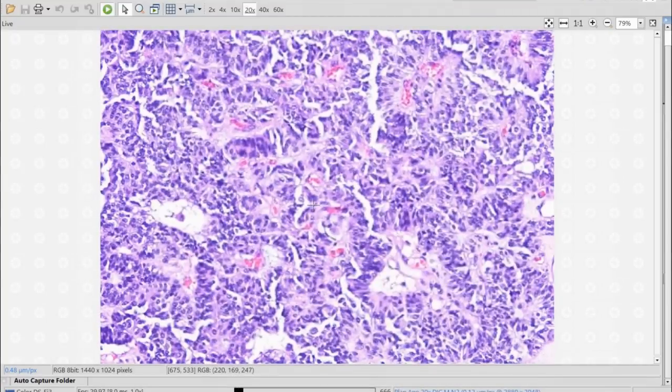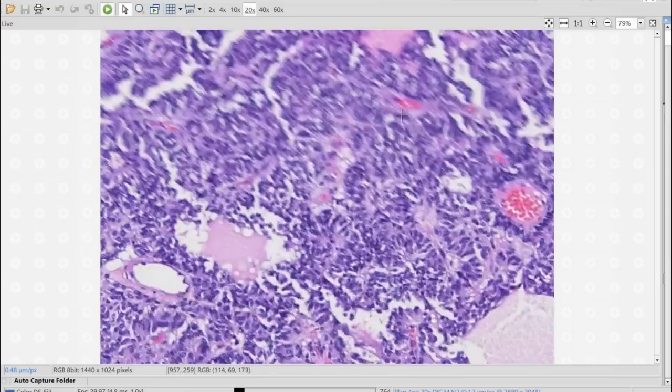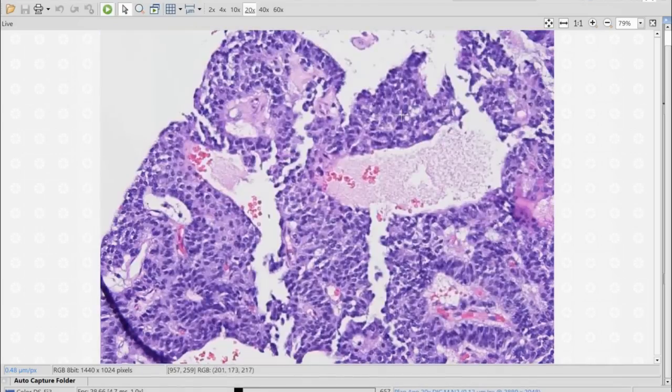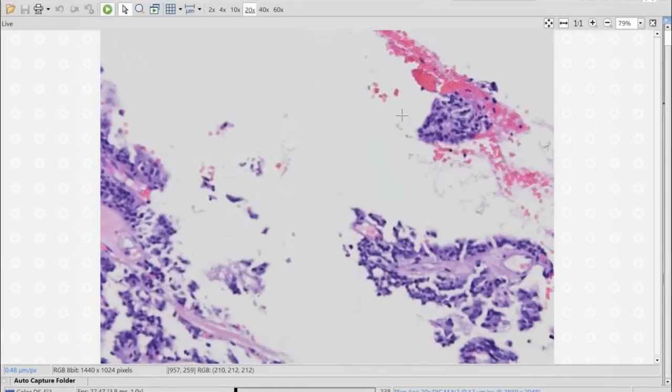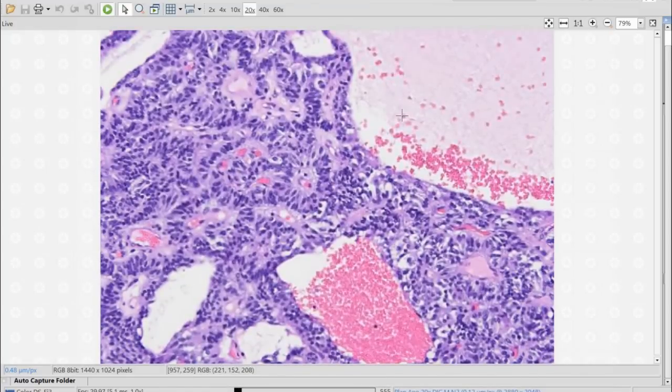And these oftentimes puzzle pathologists. As you see this, you have a vessel, you can say, well, there's a pseudorosette. It looks like an ependymoma, but something is not quite right. The pseudorosettes are not well formed. There is some hyalinization around a little bit. Circumscribed tumor, filum terminale. And this is actually a paraganglioma of the filum terminale. It's another important differential diagnosis. It's relatively rare, but it does occur there.